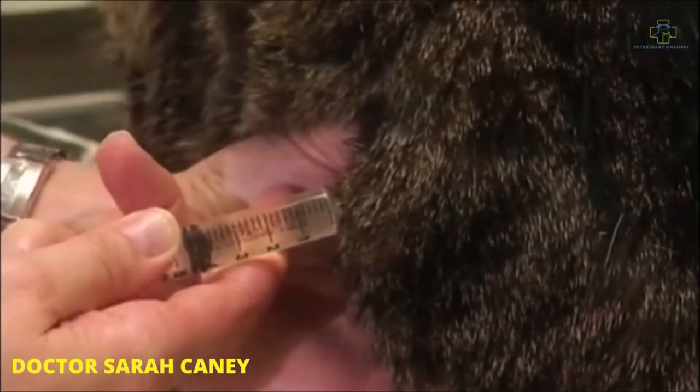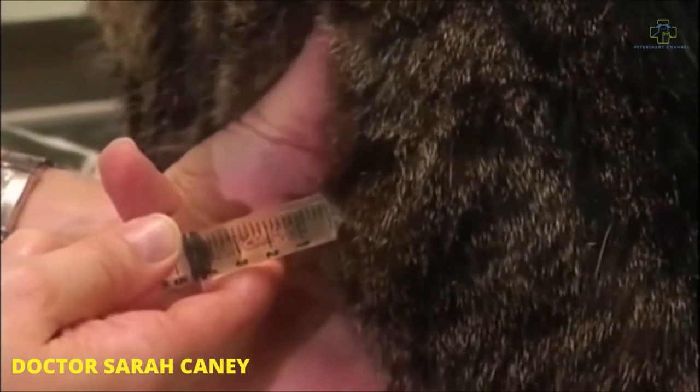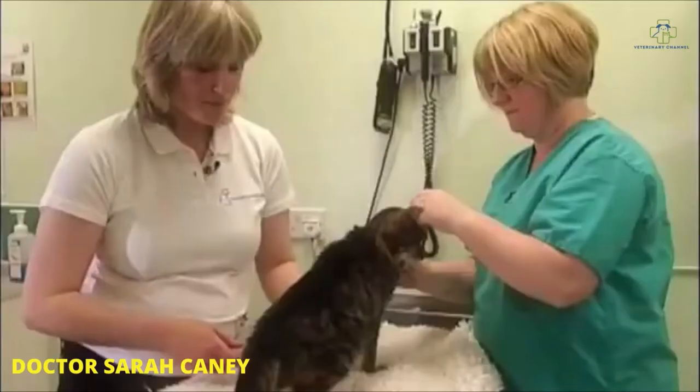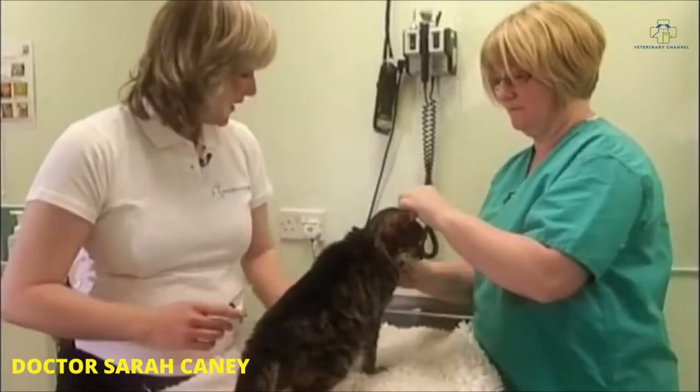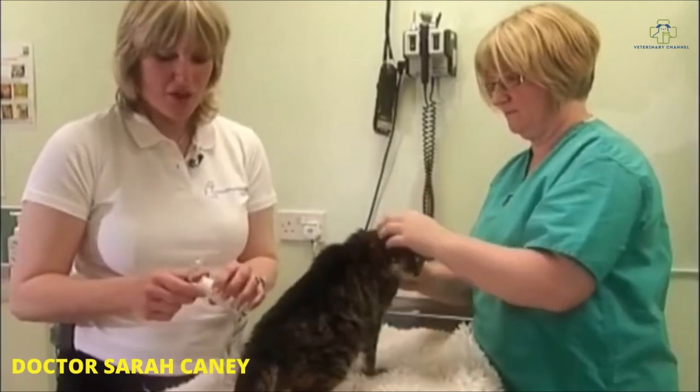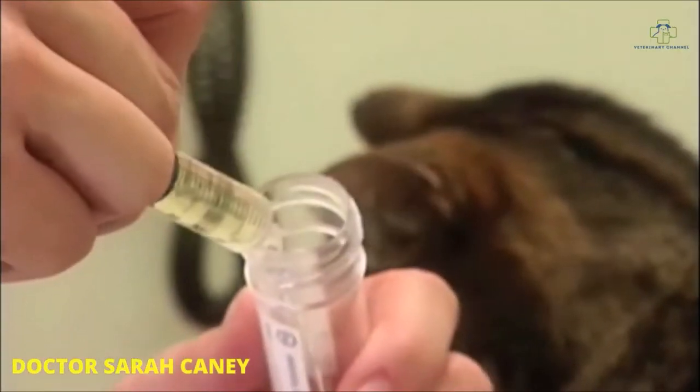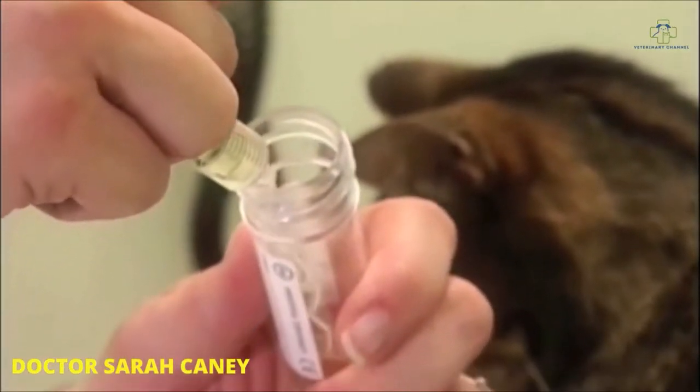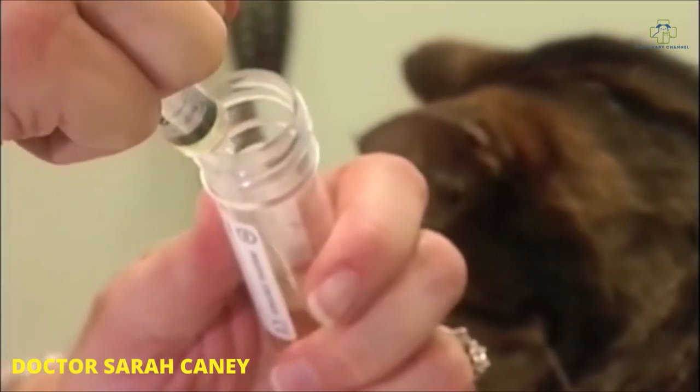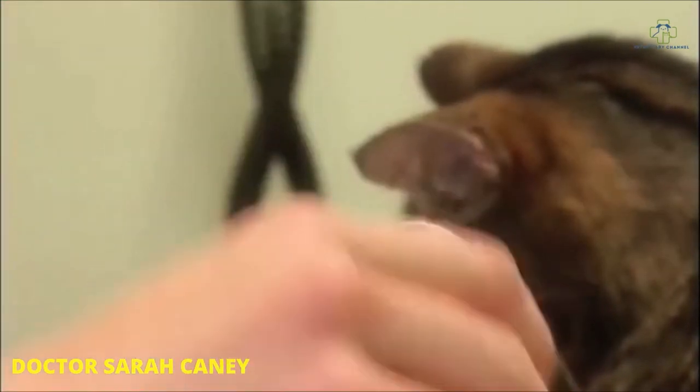Once I've collected my sample, I then release my hold on the bladder and withdraw the needle. My sample is then ready to place in a collection tube. Five mils of urine is generally adequate to do all of the tests that we need.